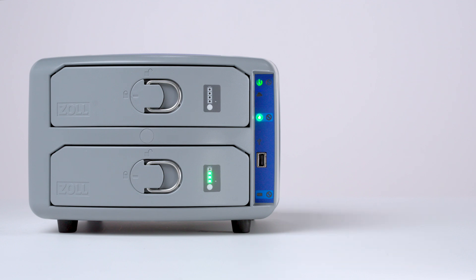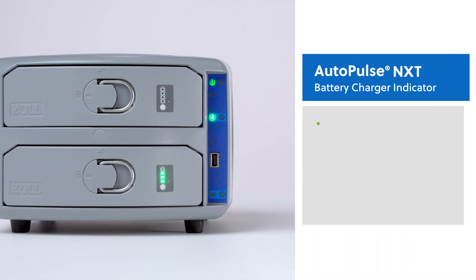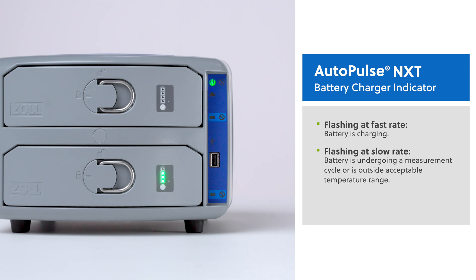On the battery charger control panel, the battery charge status indicator will provide status updates on the battery condition. If the battery charge status indicator is flashing at a fast rate, the battery is charging. Typical charge time is up to two hours. If the battery charge status indicator is flashing at a slow rate, the battery may be undergoing a measurement cycle or may be outside of the acceptable temperature range. In either of these situations, leave the battery in the battery charger until the measurement cycle is complete or until the temperature returns to within the acceptable range. If the battery charge status indicator remains illuminated, the battery is fully charged and ready to use.